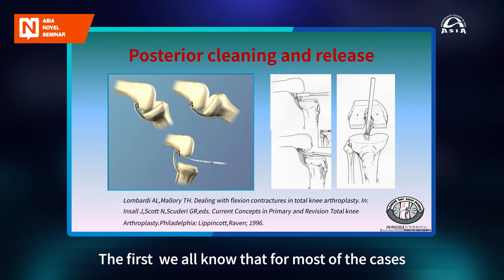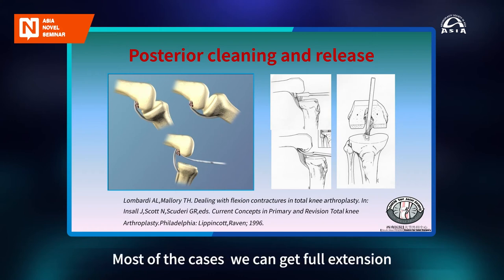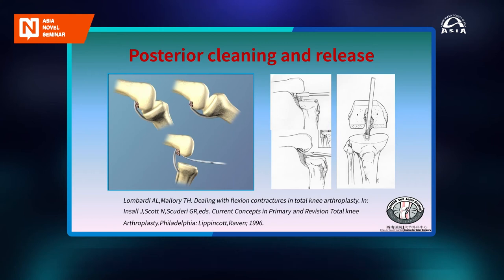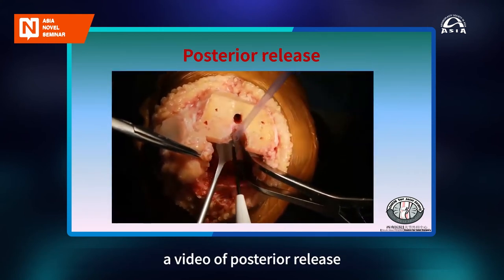Now first, we all know that for most of the cases with flexion deformity of 15 to 20 degrees, after we clean the posterior osteophytes and do some release from the posterior femur and tibia, in most of the cases we can get full extension. So here we're going to show a video of posterior release.